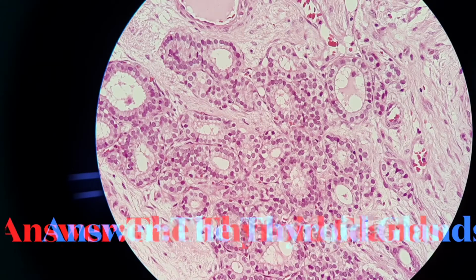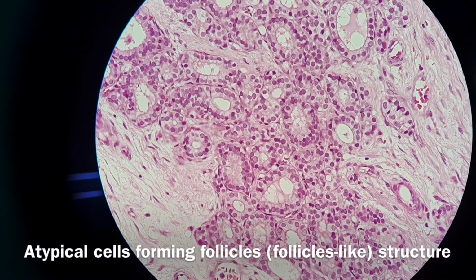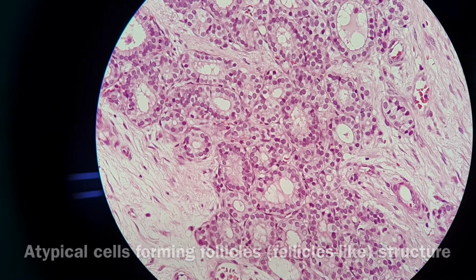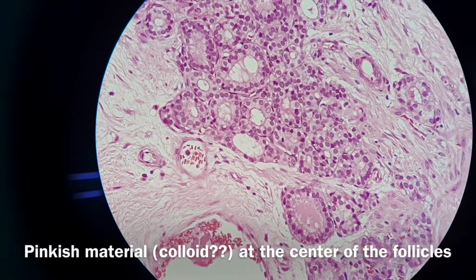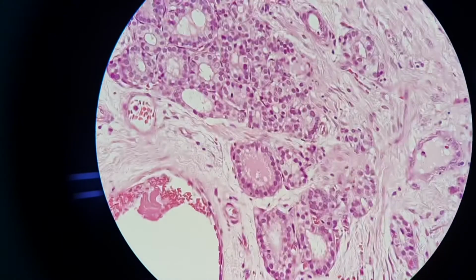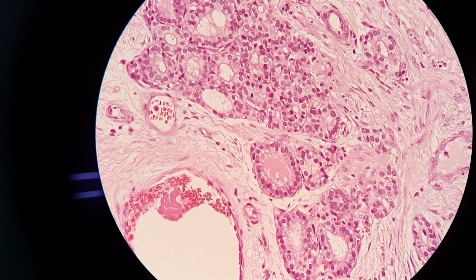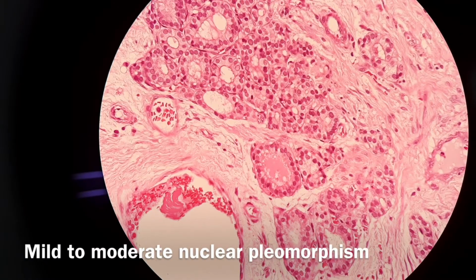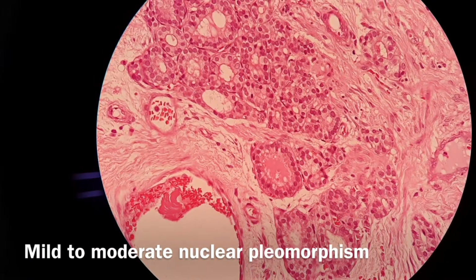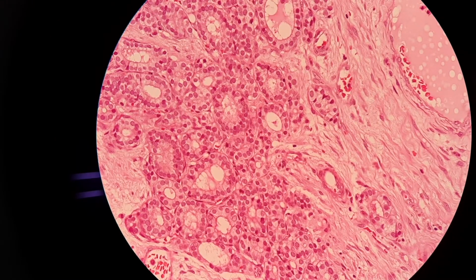So the answer is the thyroid. You can see there are some atypical cells forming a follicle-like structure with some secretion at the center of the follicles, which is pinkish in color, and the cells that line these follicles have mild to moderate pleomorphism. Sorry about the color, it's auto tuned.